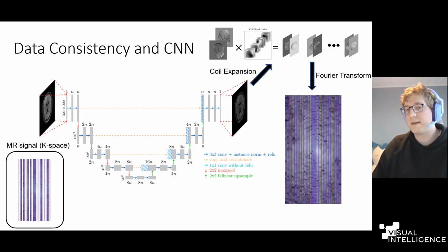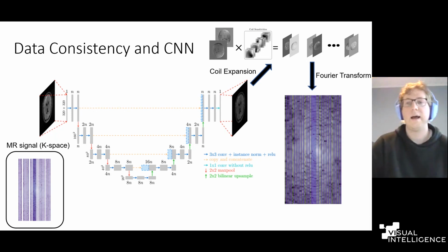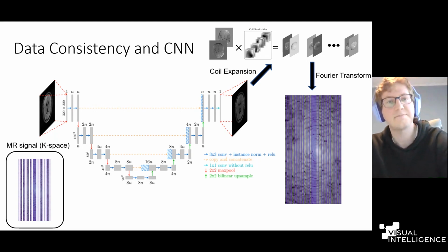You just copy paste it over onto the predicted data. And then you have a prediction of 75% of the data, and you have the ground truth of 25% of the data. The exact way these are copy pasted is determined based on the method. I just use the weighted sum. It's what works best in my experience.